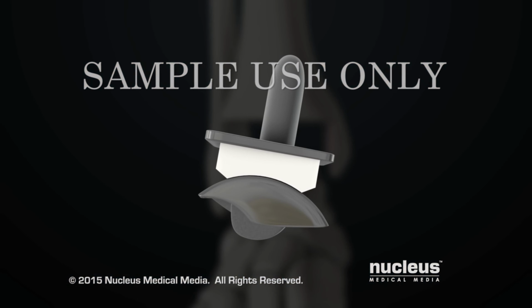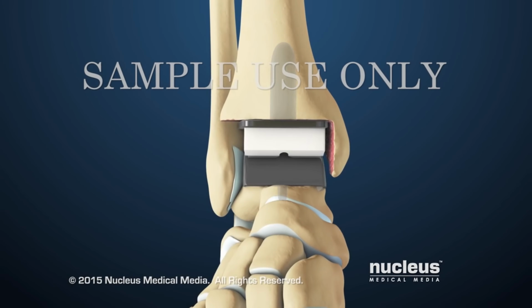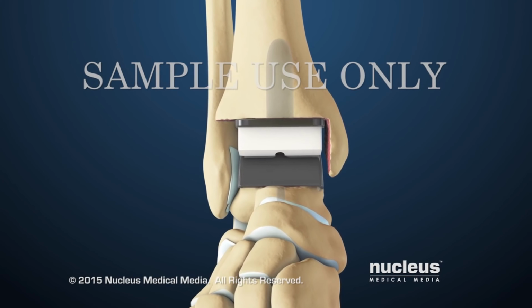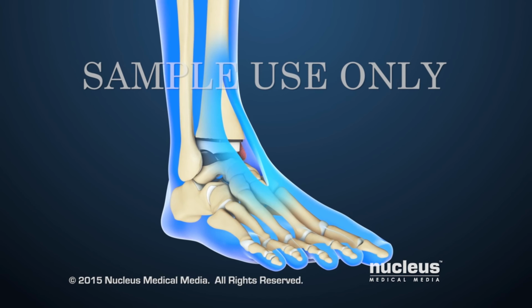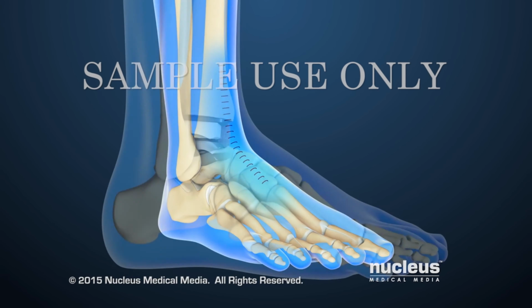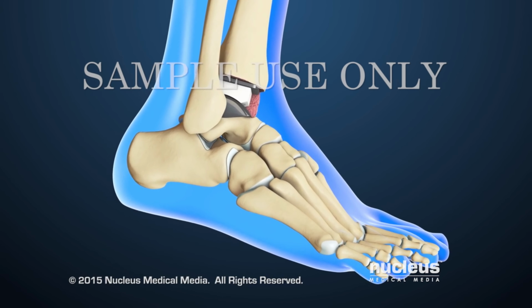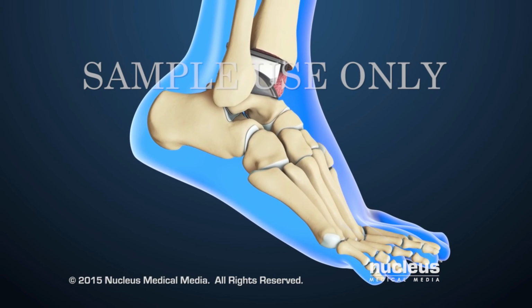A man-made joint called an implant or prosthesis will be inserted into the ankle. At the end of the procedure, the incision will be closed with stitches. After ankle replacement, the patient will be able to move the ankle more fully and experience less pain during activity.